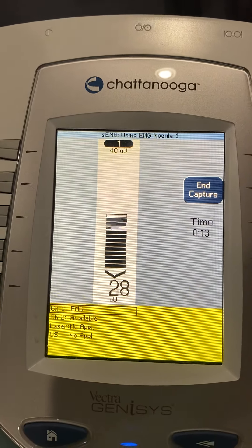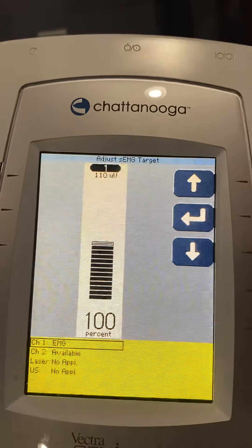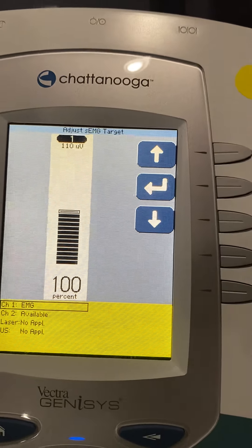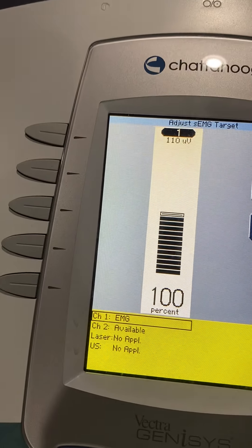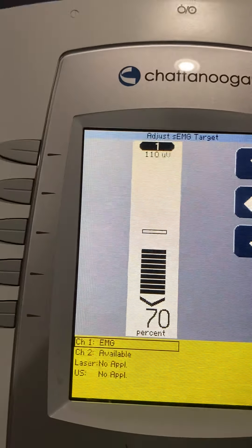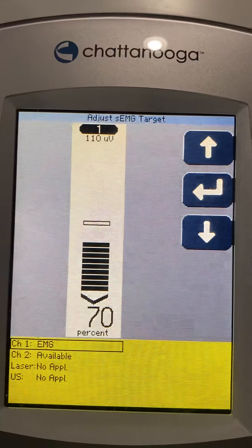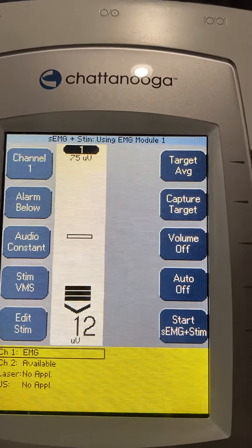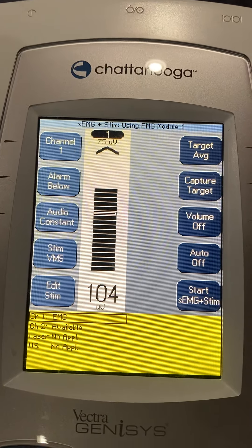Contract as hard as you can — then we'll end capture. If she's spasming, that's kind of where she is all the time, so I might keep it at 100% early on, because if she relaxes at all she'll be below the target, which is what we want. Or I could bring the target down — if 100% was her spasming level, maybe we go to 70% — we want her to contract only 70% or even less of that number of motor units. As long as she's below the threshold it'll be quiet and relaxing.